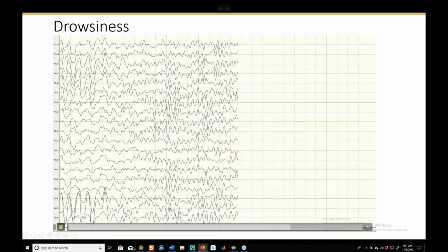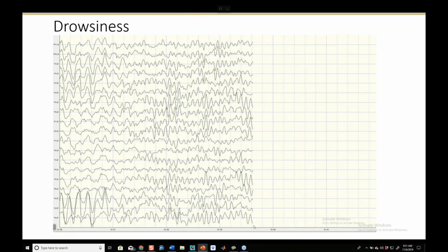So I'm going to hit pause here. This combo is what's called a K complex. K stands for knock, because if you were to knock at this point in the recording, this person would not awaken because they have sleep spindles, which is a stabilizing mechanism of sleep. It's one of the reasons why one way to train sleep is to enhance the presence of beta 1 or SMR. But what's happening is we have the spindles of sleep paired with a vertex slow.